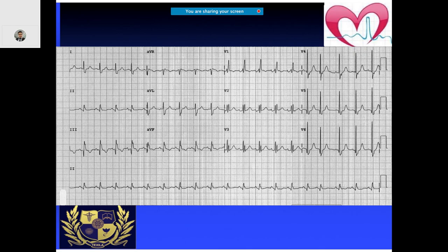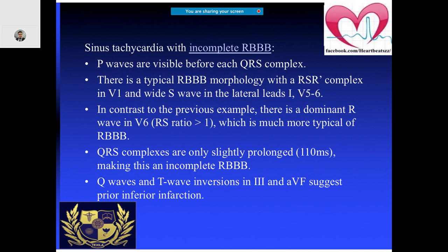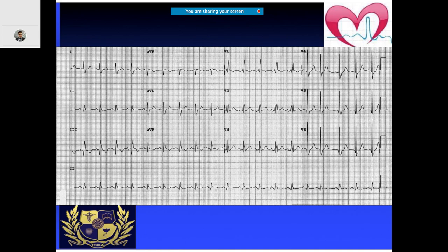In this ECG you notice a right bundle branch block pattern, and there is also a Q wave in the inferior leads. This indicates a prior inferior infarction. The QRS is slightly prolonged, there is RBBB, but there is a P wave before all these complexes. So this is more of a sinus tachycardia.